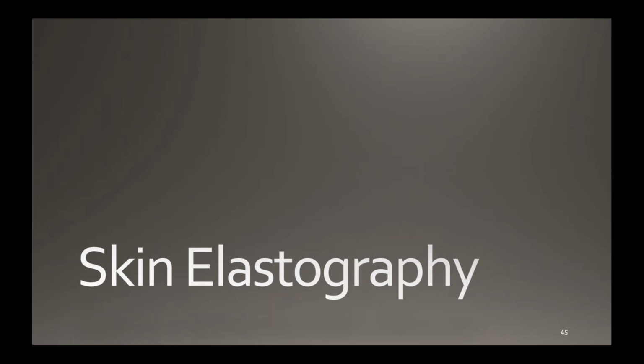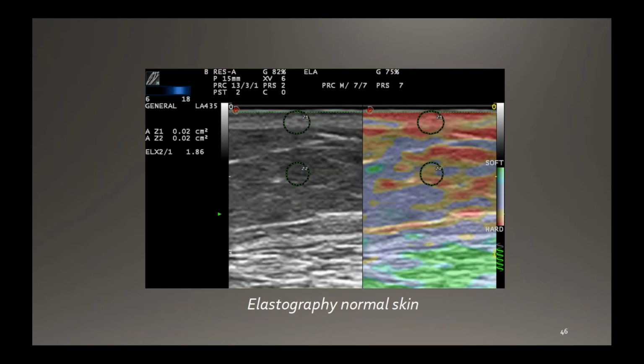A couple of words regarding skin elastography. That's something that you can also offer to your patients. In this skin elastography, you can also assess with superficial probes the elastography of normal skin. Normally, dermis tends to be harder than subcutaneous tissue, more or less with this kind of relationship.